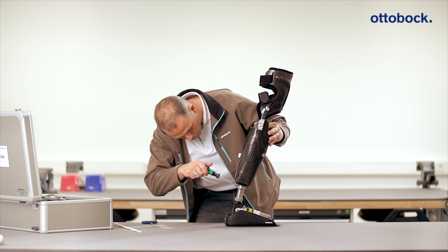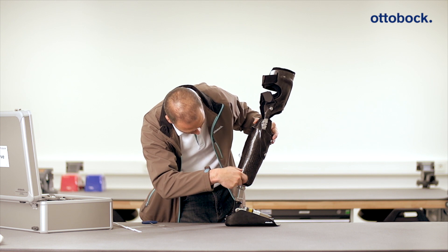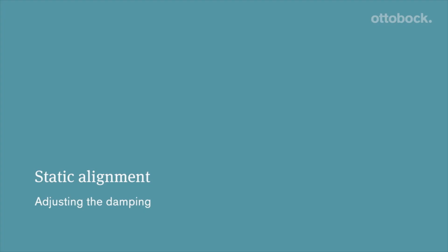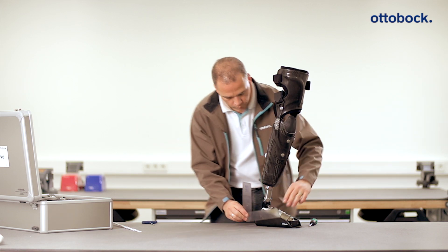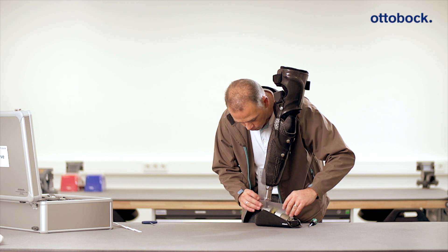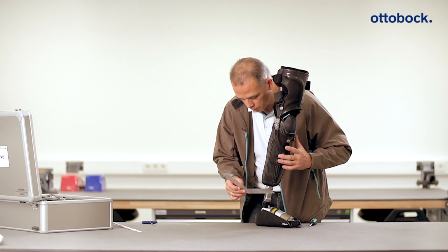For the transtibial sports fitting, we recommend using a thigh sleeve to stabilize the knee joint. Now check the recommended basic values on the hydraulic cylinder and the pneumatic system and adjust them if necessary in the event of discrepancies. Note that these are merely basic values that need to be individually adapted for every athlete.